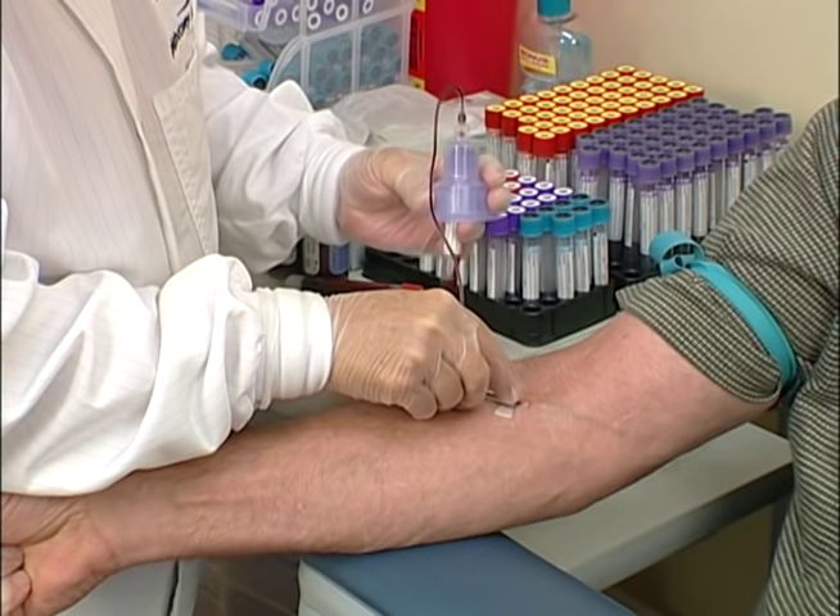After filling the blood culture tubes or vials, fill the other tubes in the prescribed order of draw.